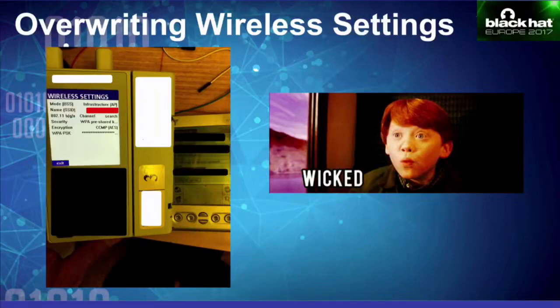We took all the settings from our rogue wireless access point and filled the template with all those settings. So we put in the wireless access point name, our own username and password, security settings, WPA, WPA2, etc. Once we did complete the whole template, and it was a pain to type it in there, when it was all done, we attempted to beam it back to the infusion pump over IRDA. And that worked. We never thought that would work. It was just done out of boredom.